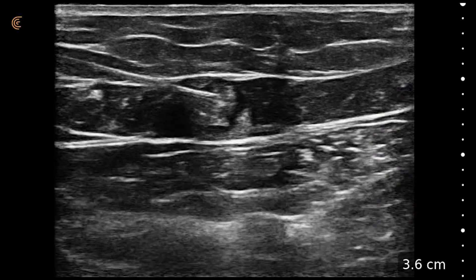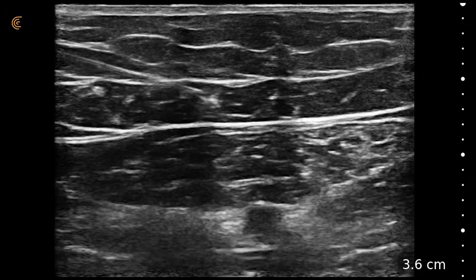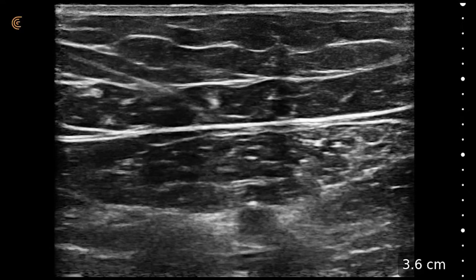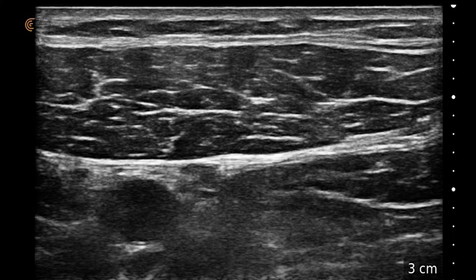Sometimes we'll just infiltrate right across. So this is our typical patient — you can see we're about a centimeter deep. Now this is an NFL player I just did about a week ago, and you can see from the skin to his sartorius is like a half a centimeter deep or less. So this guy doesn't have the fat that the last patient had over the sartorius.